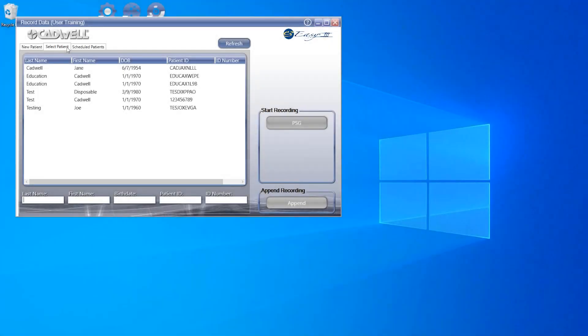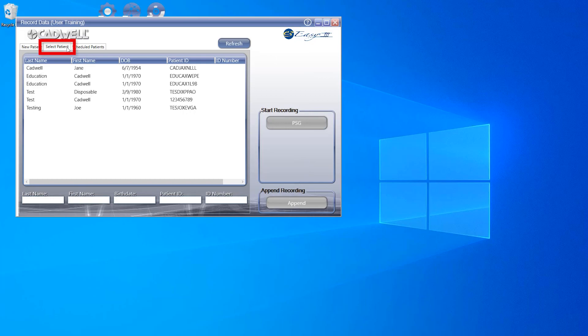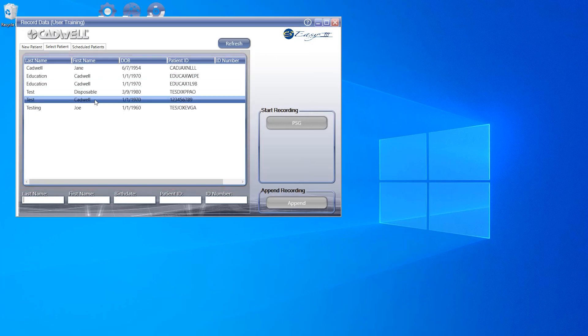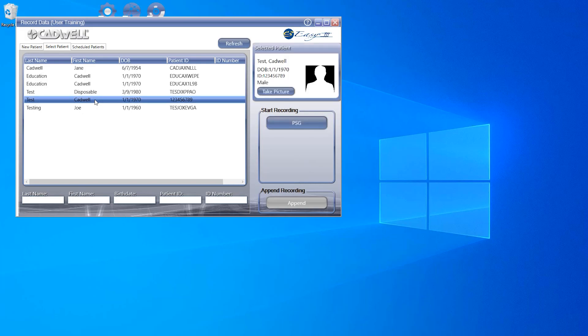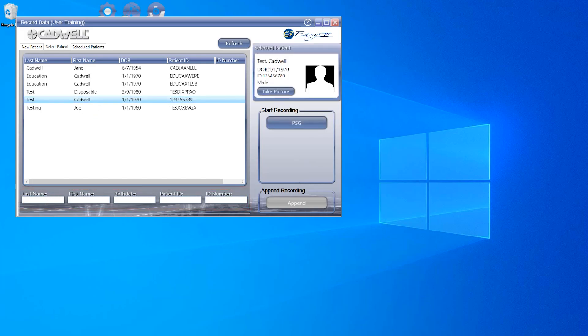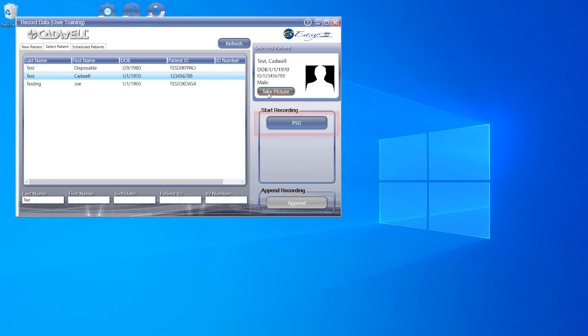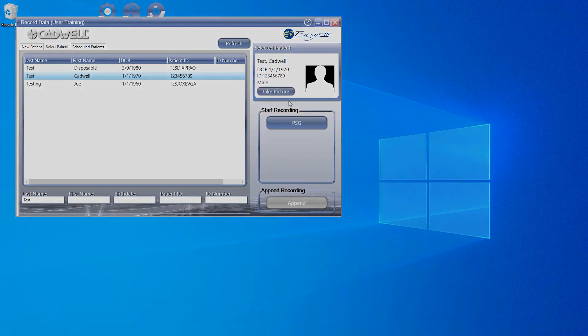Utilizing the Select Patient tab is another way to start a new recording. Under this tab, you will find a list of all patients that have previously undergone a test at your facility. You may scroll through the list of patients to find the correct patient, or you can even search for the patient using the fields along the bottom. Once you've selected the appropriate patient, you can take a new photo if the current photo displayed is older. Now select the PSG button to start your recording.